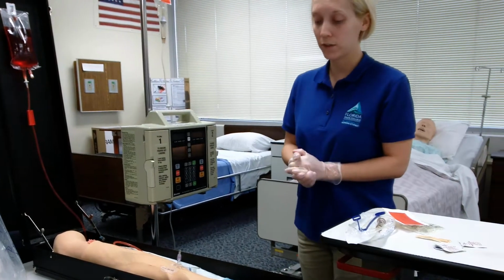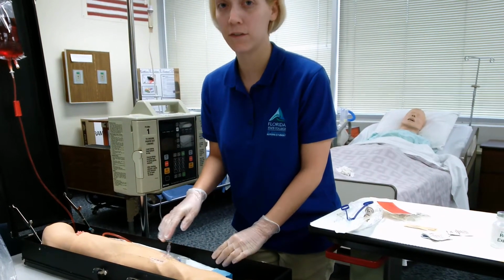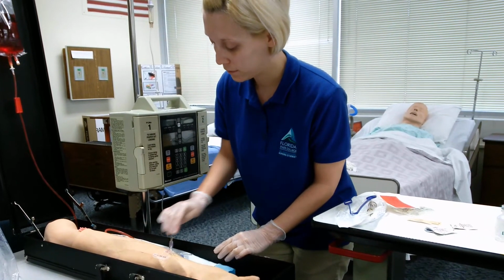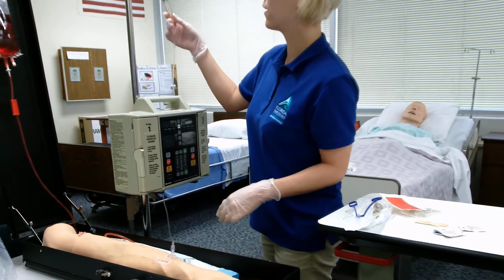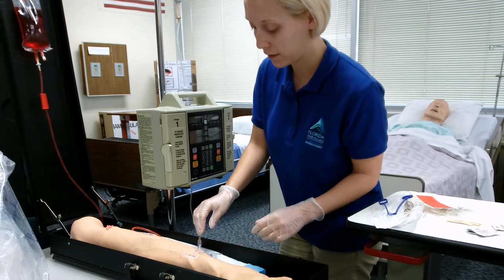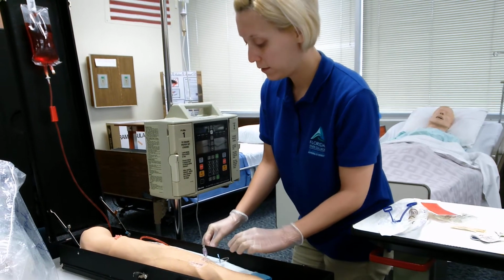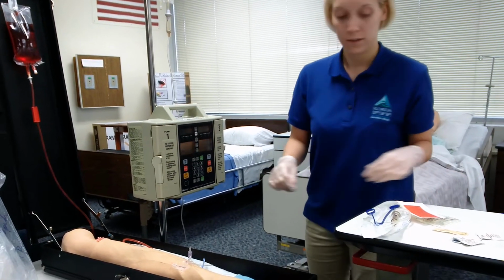Okay, so the first thing I'm going to be doing is checking for any phlebitis or infiltration. Does that hurt? No? Okay. We know that's already running at 17 drops per minute. I'm going to go ahead and stop, clamp that, and I'm going to hang my secondary.